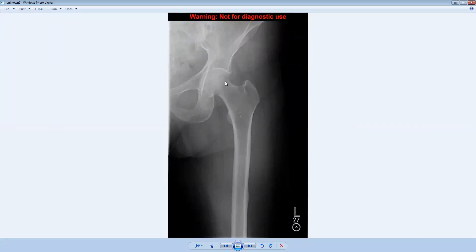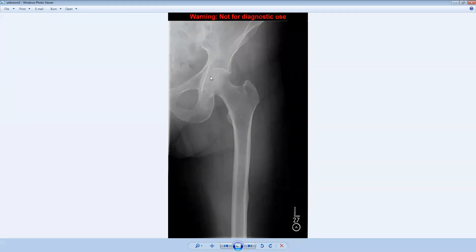If we take a look here, we have a frontal view of the left hip and left femur. This is the femoral head, this is the femoral neck, and this is the femoral shaft. The femur is articulating with the acetabulum, and we're looking to see if there's any abnormality here.